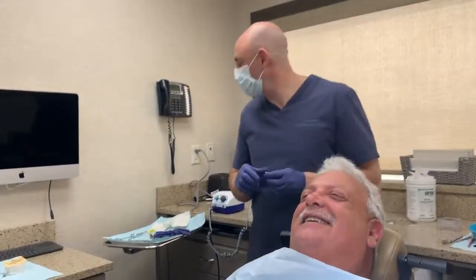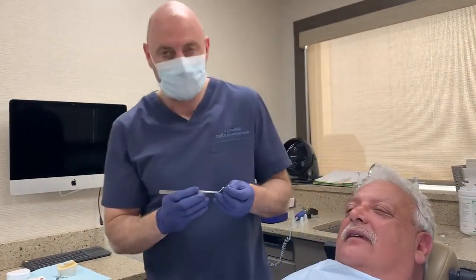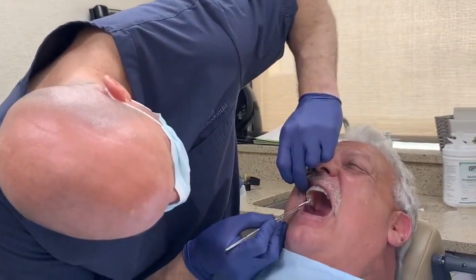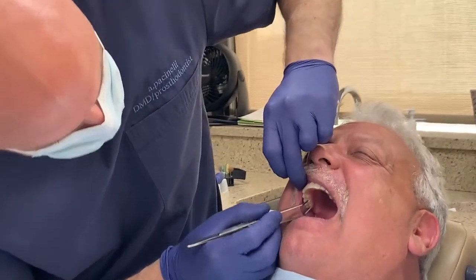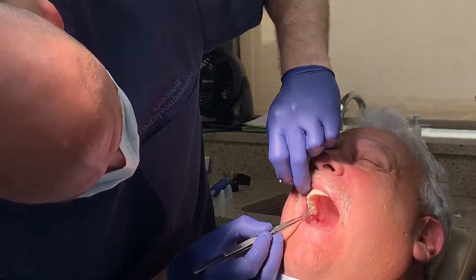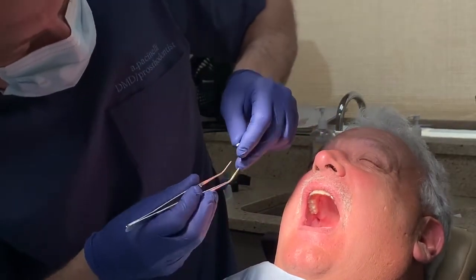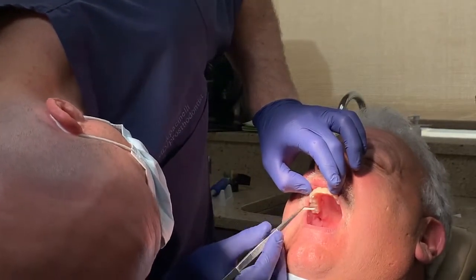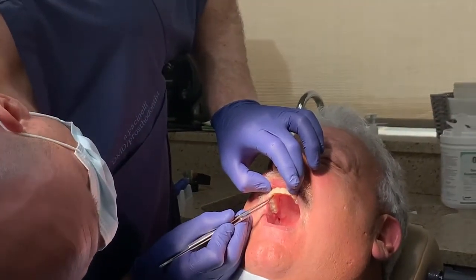People who are class 2, generally, unless they have the lower anterior teeth super erupted, their anterior teeth don't touch. I think a lot of clinicians would have closed him down so his anterior teeth touch. But I just love how it sits on his palate, with very little on the palate, and the way it sits against his tissue is great. That's a great view right here. The access holes are really in a good position.